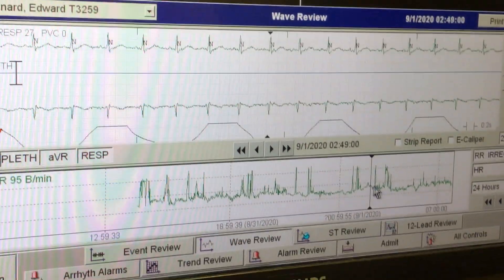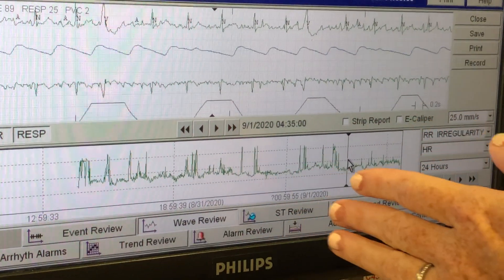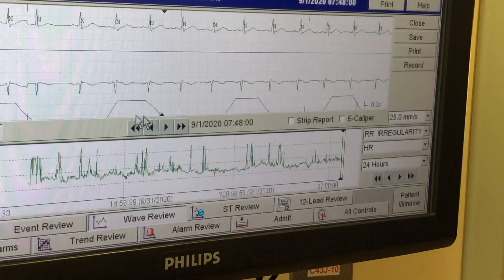If you forgot and need to go back like four hours, you can click down here and it'll show you where you want to click. If we want to do it for right now, we'll click down here.